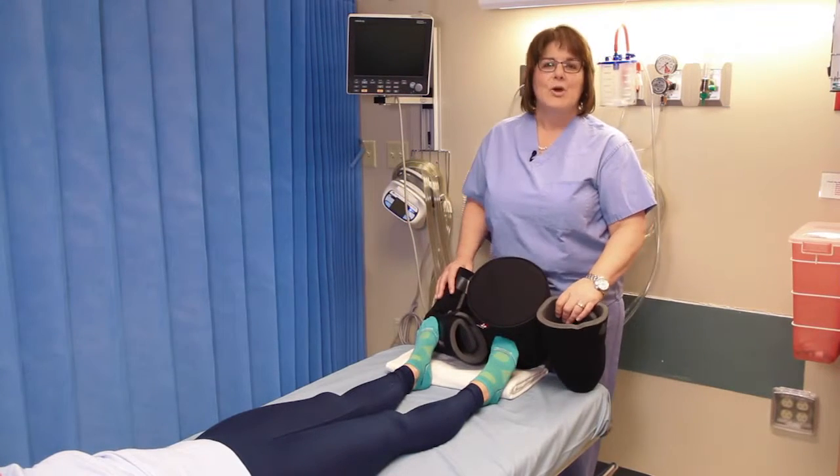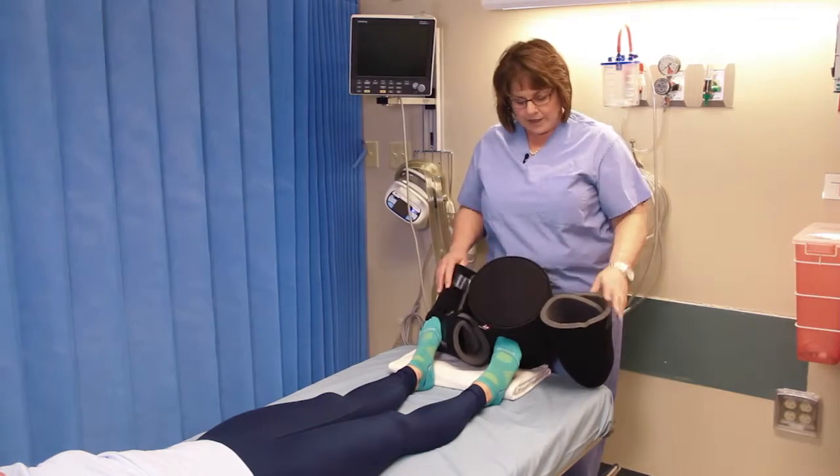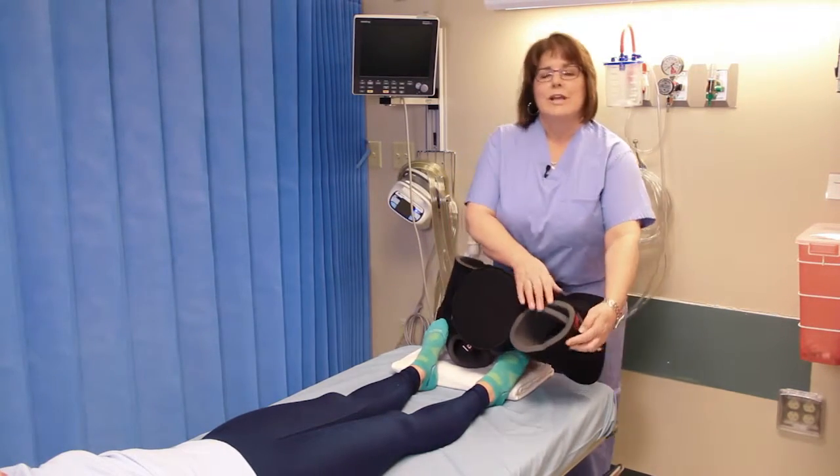Hi, my name's Naomi. I work at OA Centers for Orthopedics in Portland. I want to show you how to put on the anti-rotational boots that patients wear after a hip procedure.